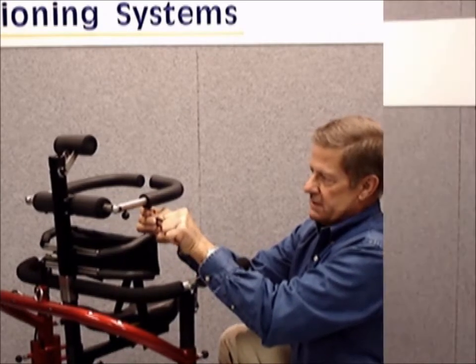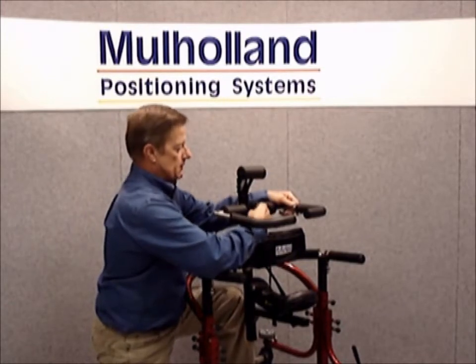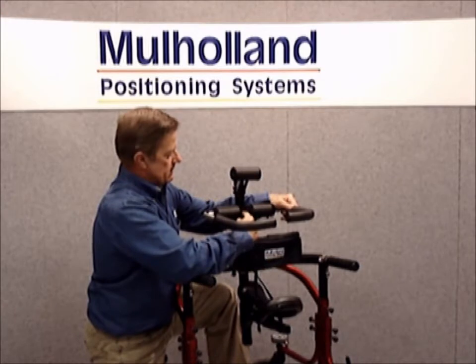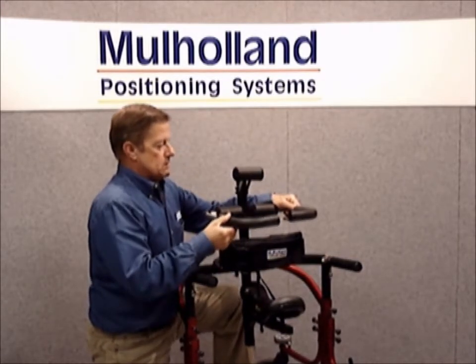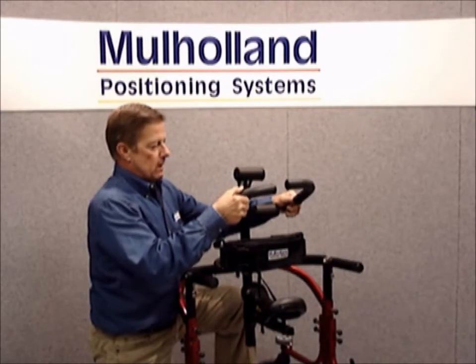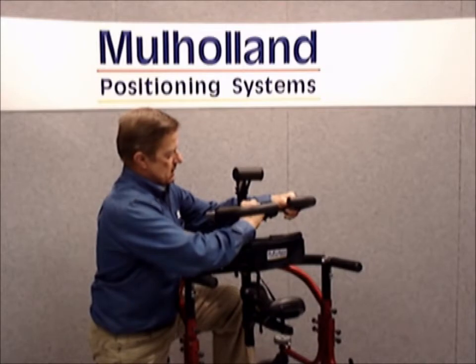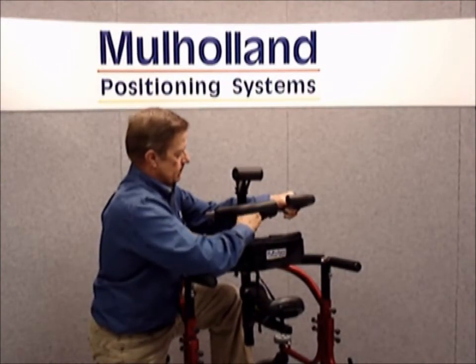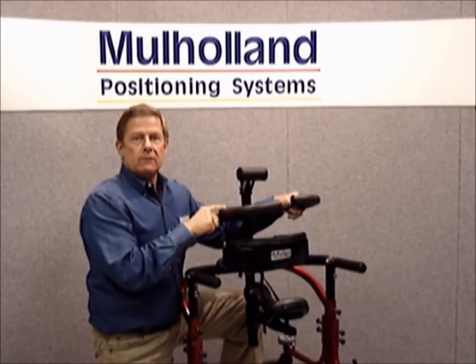Additionally, we can adjust the angle of the thoracic ring by loosening the 4 screws to the inside of the thoracic ring. That will allow us to angle the thoracic ring up or down to a desired height. Select your height, tighten all 4 screws. This can be fine-tuned after the user is in the unit.